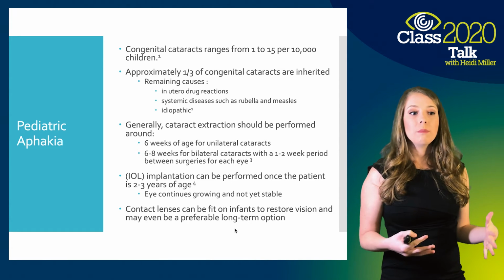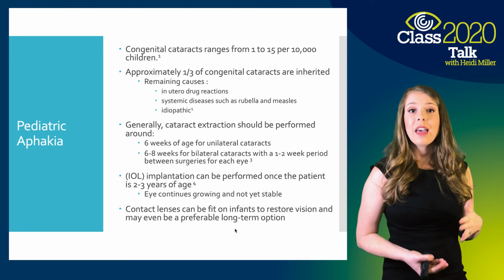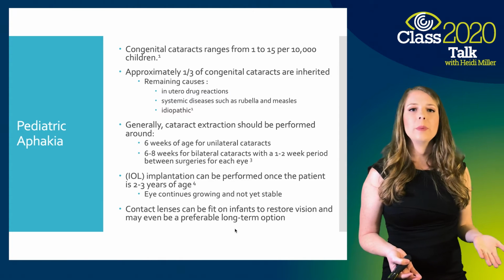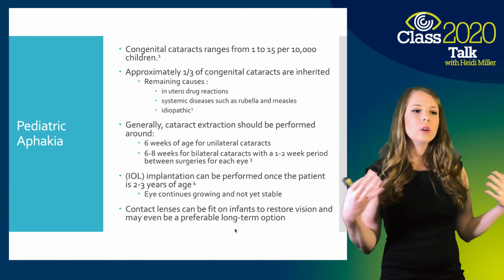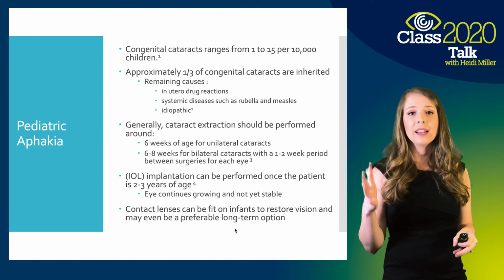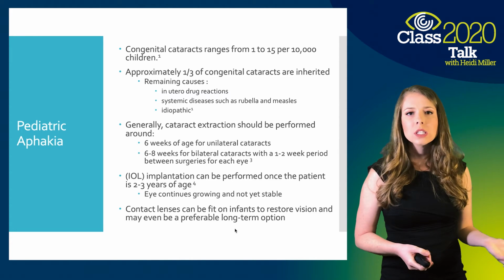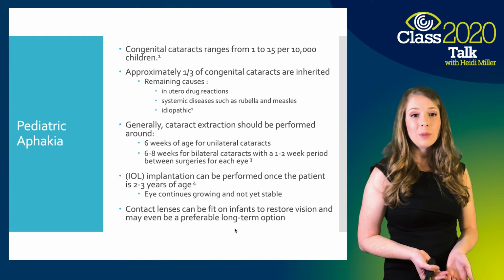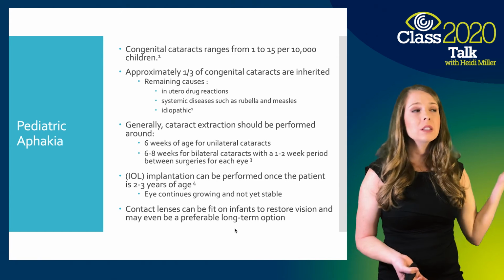But with my pediatric ophthalmologist, she said if we can wait till teenage or adult years, that would be ideal, because the risk of developing complications or glaucoma goes down the older they are and the more developed the eye is. And so I have several patients that are 10, 11. They're doing great in contact lenses. They're seeing well. They're wearing their overlays, no problem, so we don't even talk about IOL implantation right now because it's not really necessary for them. They're doing amazing, and the families are fine going that way.